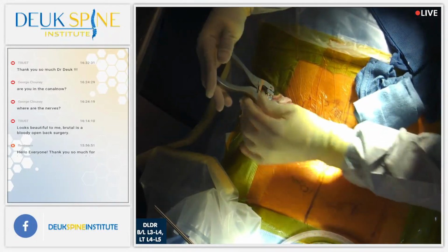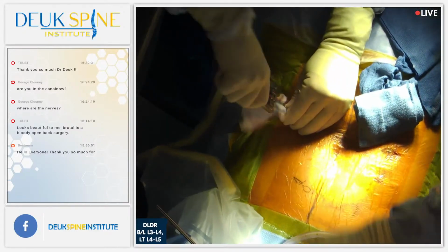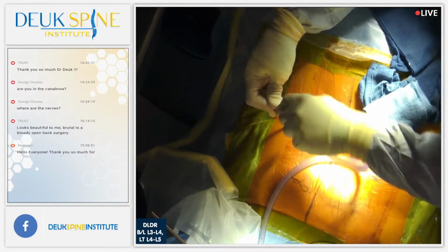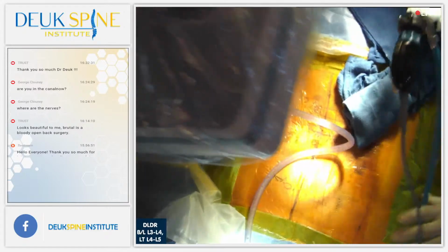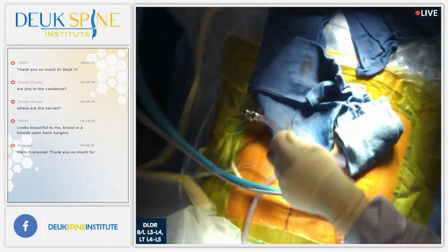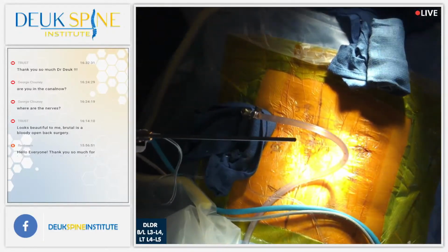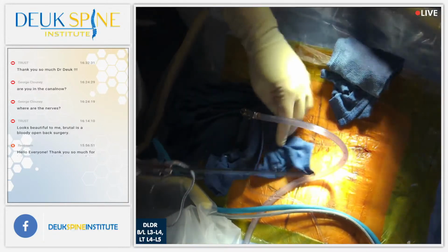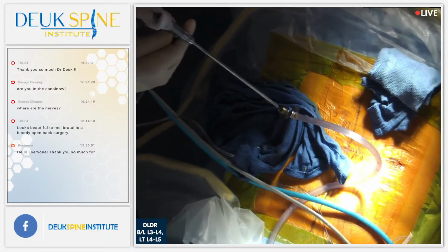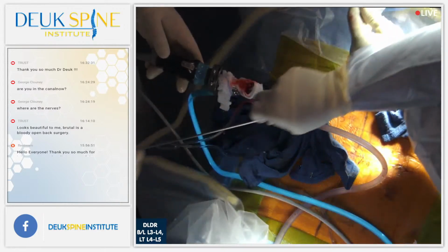Looks good. I'll do this. Go ahead. All right. Why don't you staple? Thank you. I got it. Down the home stretch. 10 minutes, Dr. Berndes will be done. Scope on, laser, or grabber.